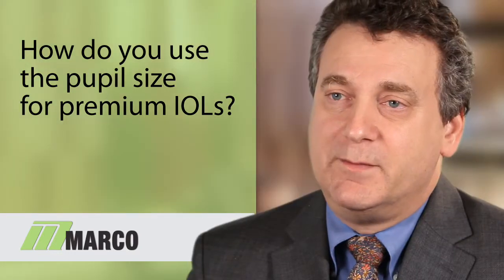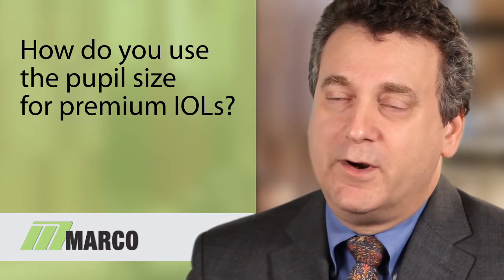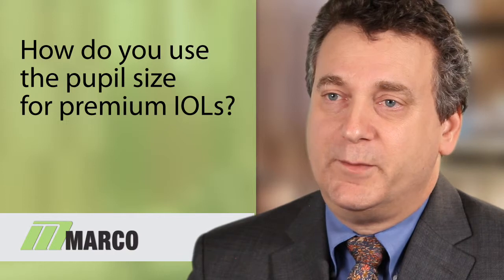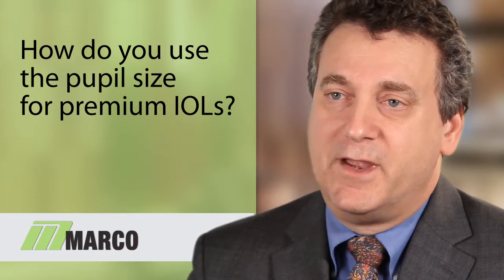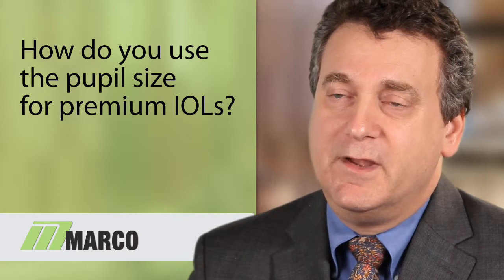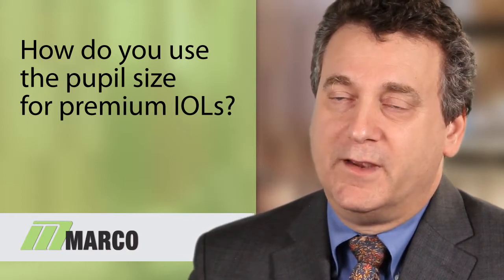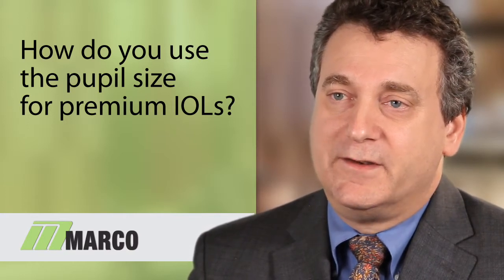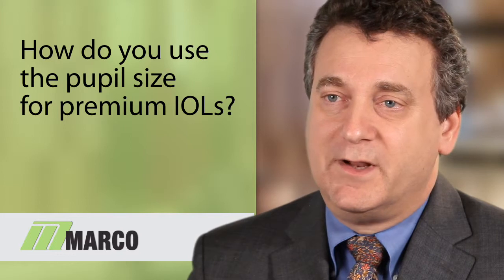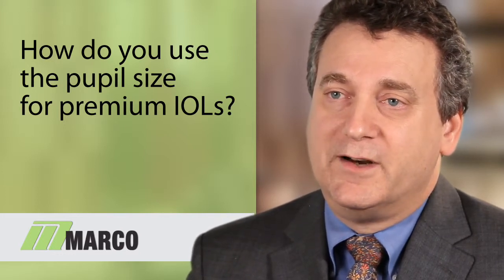If a patient has an extremely large pupil size in a resting pupil, then you may not want to go ahead with a multifocal lens in those patients. And I always had a concern, when our technicians measured the patients prior to me seeing them, whether I was really getting a true, accurate reading of their pupil size. I like to see the patients dilated if I can, so that I can fully assess their eye.